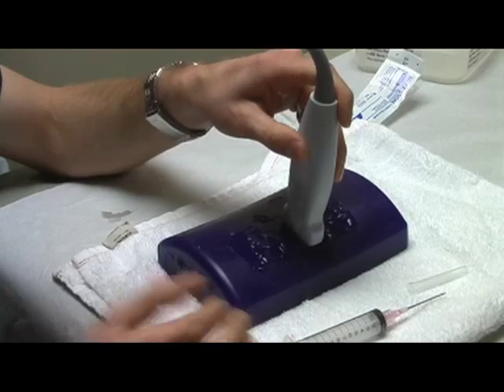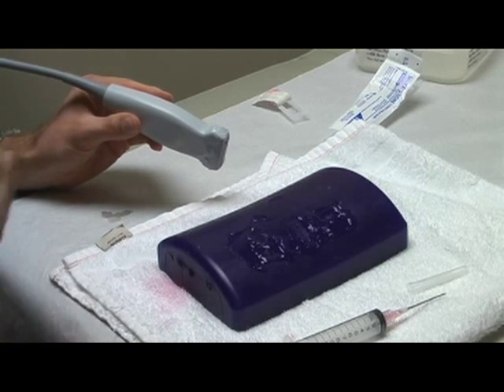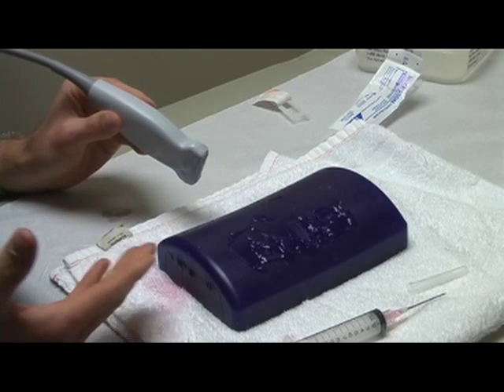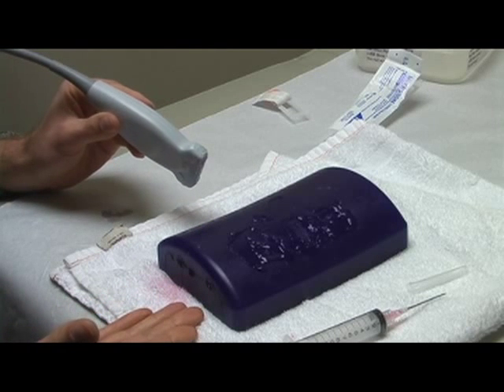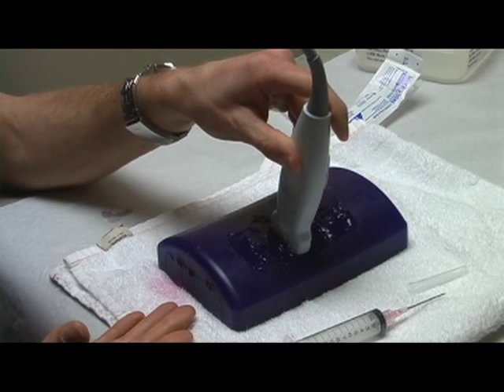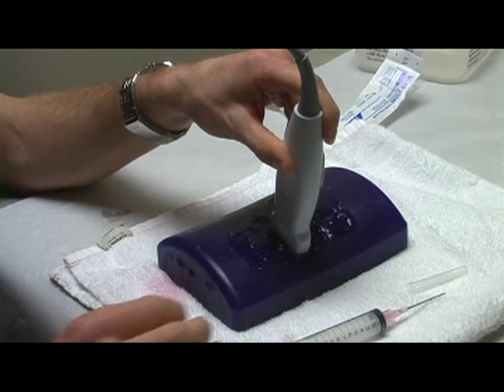So this is our other model, the Blue Phantom block itself, which allows the student to practice vascular access. A few differences here is obviously we don't see any external anatomy, and when the student places the probe on the device, they're only able to see one vessel at a time.